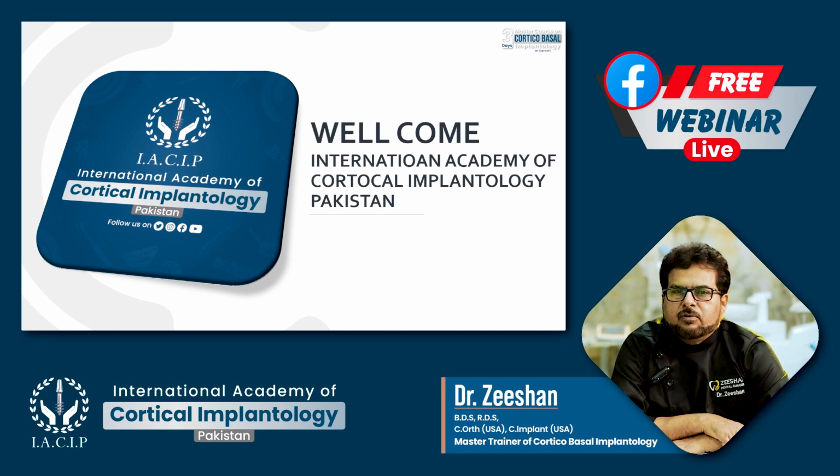But we have lost the quantity of bone, and to achieve this bone implant contact, we can tilt our implants and place them at an angle. So basal implants can be tilted. They are single body implants, and they can be placed at different angles to increase the bone and implant contact, which in turn will increase the stability of our implant.